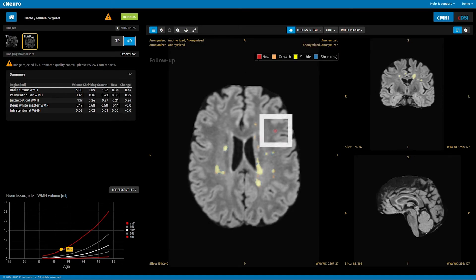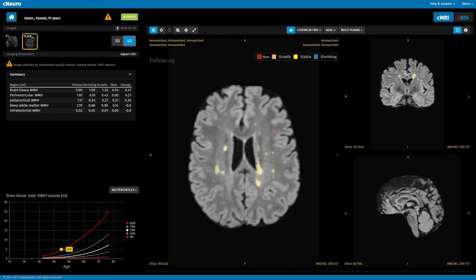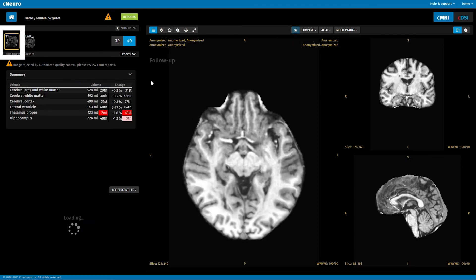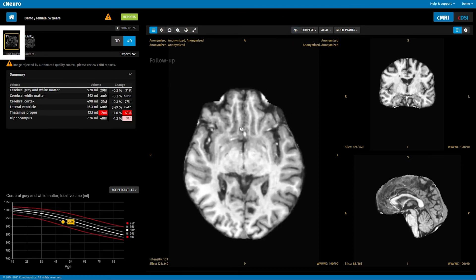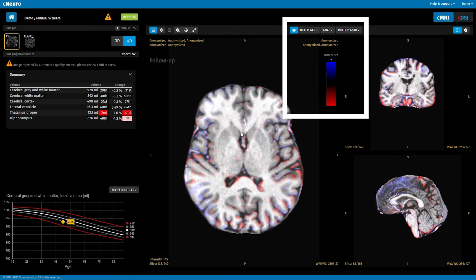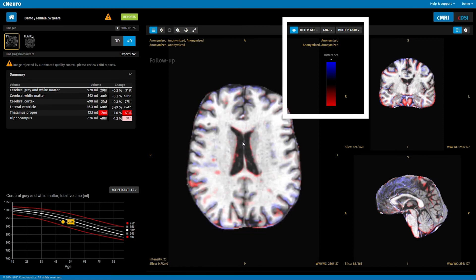Here, we see that this lesion marked in red is indeed a new lesion. In the same way, you can toggle between follow-up and baseline for T1 images, and you can review a subtraction image to get an understanding of volume changes between the scans.